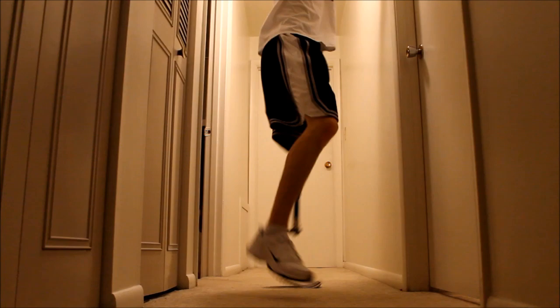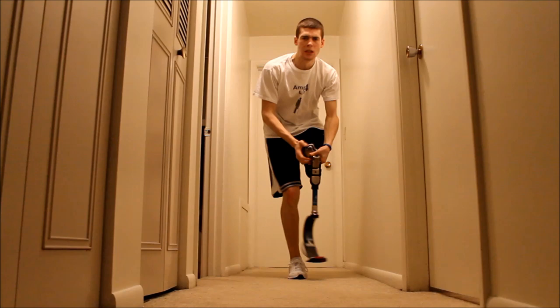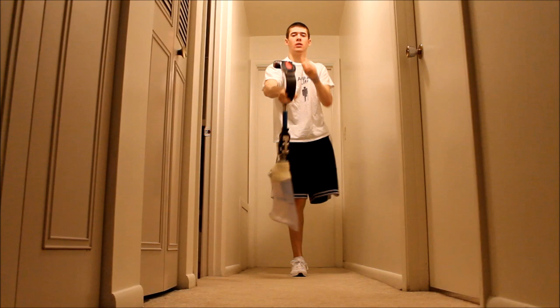Now I'm going to do the side step. I'm going to hop some more. There's my leg, guys.